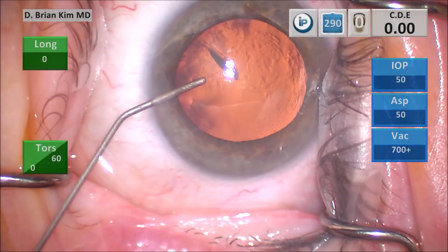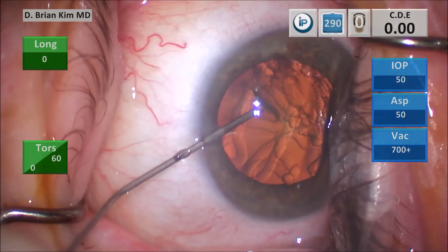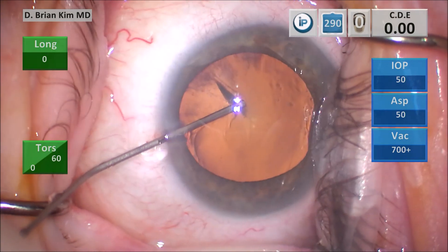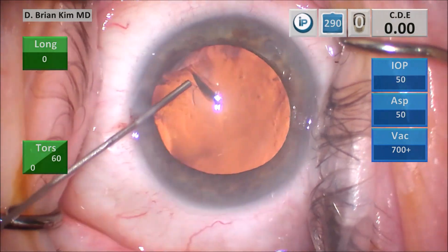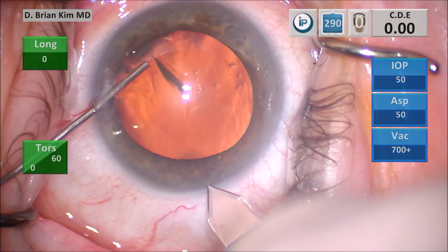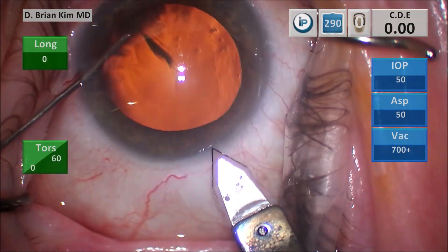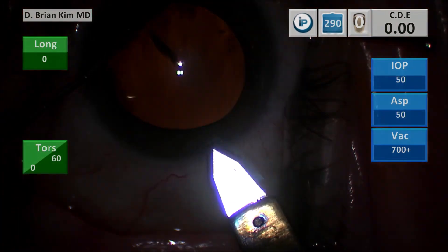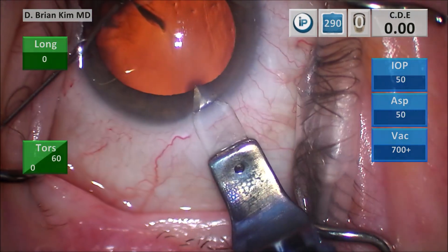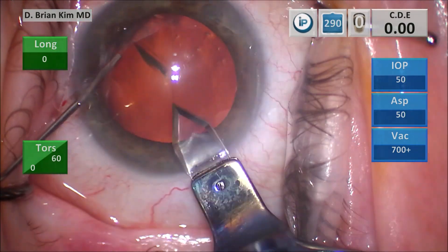I'm injecting some intracameral lidocaine, and I'm injecting some dispersive viscoelastic to fill the anterior chamber and flatten the anterior capsule. I'm using the cannula to turn the eye away from me, and then I make a vertical groove, trying to place the blade into the deep part of the groove. This patient is not reliable with his movements. I'm tunneling through the cornea, and then I use the cannula to turn the eye towards me, and then I enter. That's the triplanar corneal incision.